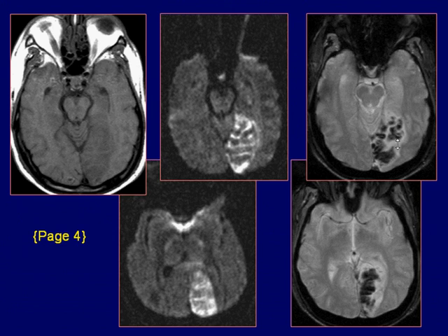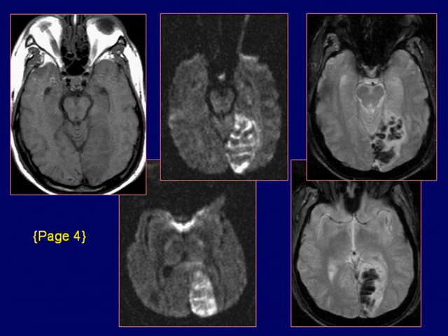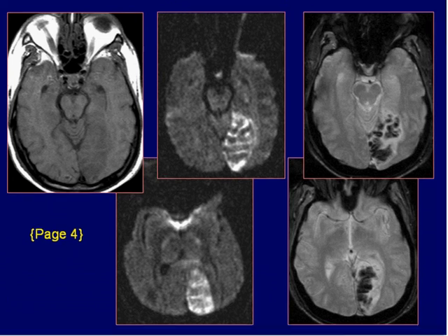Gradient echo, or T2-star, images demonstrate susceptibility artifact of the cortical gray matter greater than subcortical white matter of the left occipital lobe. CT and MR findings are consistent with hemorrhagic left occipital cerebral infarct.